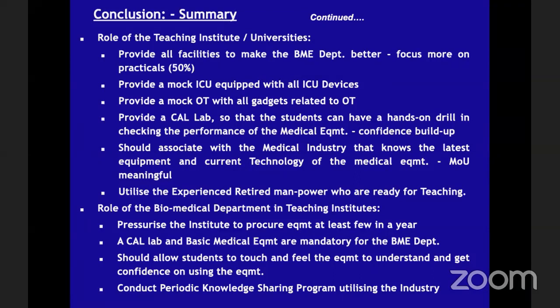You also should have a CAL lab, a separate lab. Create a fault in the patient monitor, remove the cable, put a defective cable, so that the students can take it to the CAL lab and check the performance of the patient monitor with the patient monitor simulator.